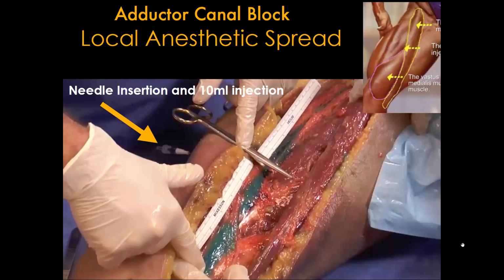And they want you to come in at a flatter angle, so they don't want you right next to the probe with this one, but maybe come out here and then you can get in that plane better. Otherwise, it's going to be hard to make a turn once you get in there.